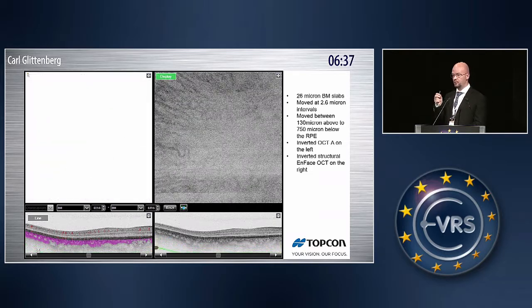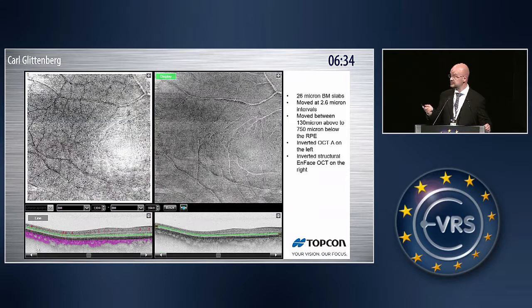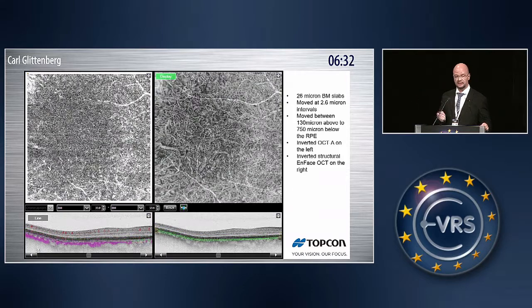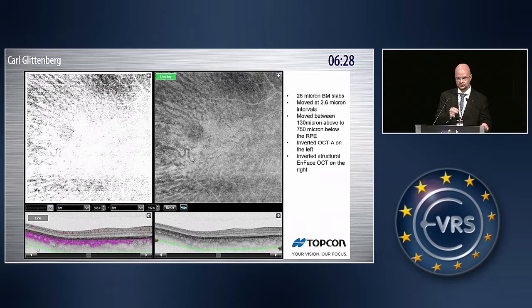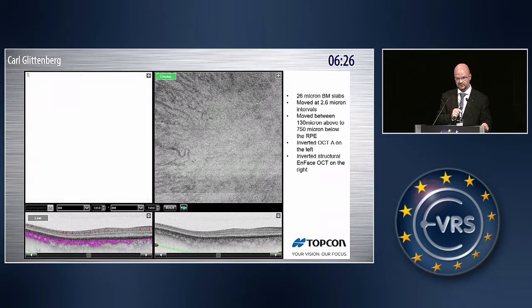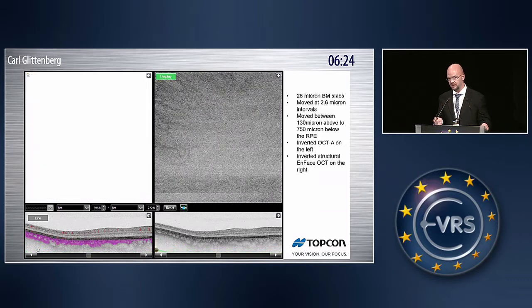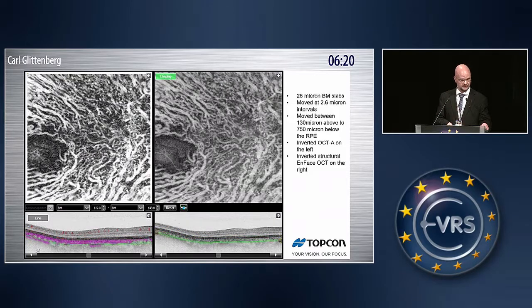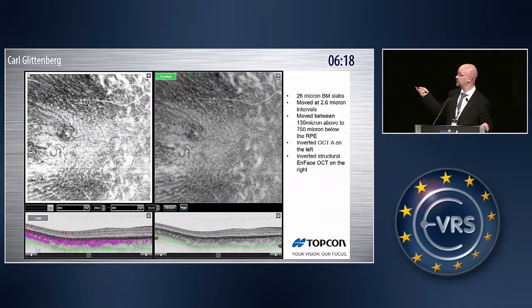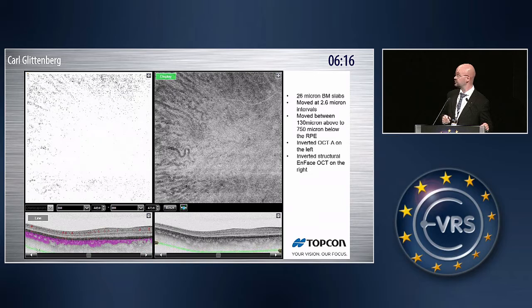But I want to really point out, and this is very important, that this visualization does not show the movement of blood. It just shows the vessels around it. And since it's not showing the movement of blood, I call it not angiography, but vasculography, because it's showing the vessels. So I've called this choroidal vasculography, or CVG for short.